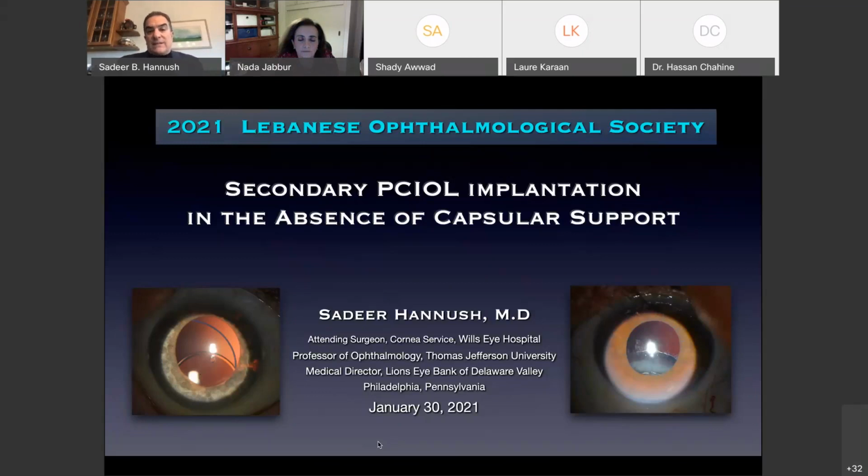And what I would like to say at the outset is that much of the surgical techniques that I'll show today, you have access to, either through your faculty or your colleagues or on YouTube or other media. So you have access to all the techniques. The question is how to approach these patients in your practices, whether academic or private.